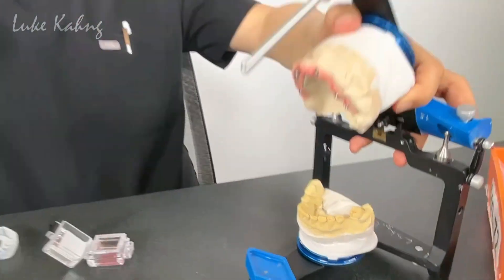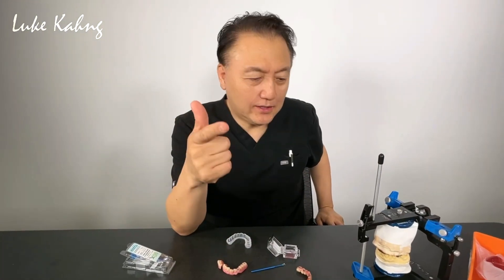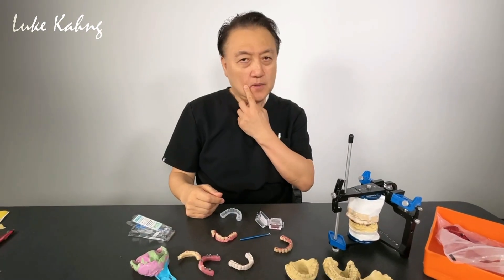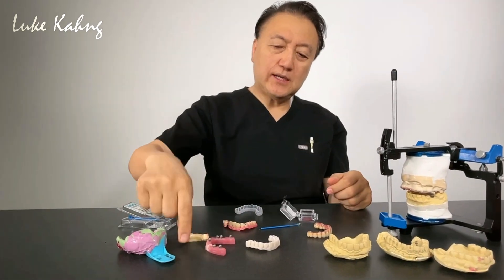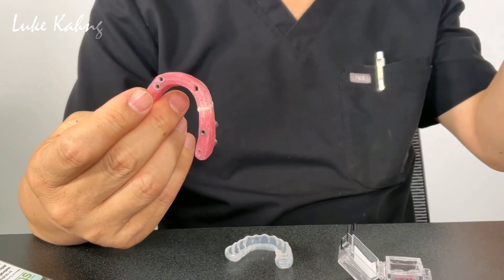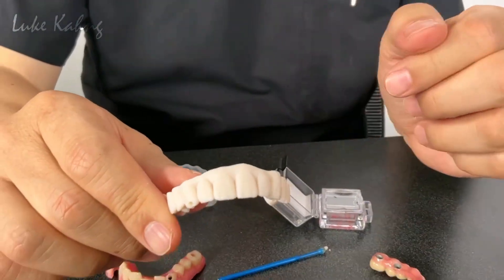People kept asking why we do it this way. I like the tooth movement, especially for lower teeth. Most times patients don't have much money — they have to spend on vacation, kids' college, or a house — so they can't do top and bottom at the same time. We have to make sure all the prosthetics are verified before going in the patient's mouth: wax-up, PMMA, verification jig in analog style, or digital style using photogrammetry. Then we make the printed temporizations.